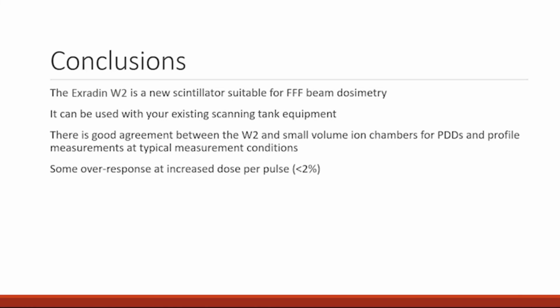A decrease in the blue signal. So we don't see the separate channel output. Maybe you can, but we just saw the final post-processed output, and so I didn't see a decrease over longer irradiations. And most of our irradiations were very short, 100 or 200 MU. Sure. Or we were scanning. Yeah, that makes sense.